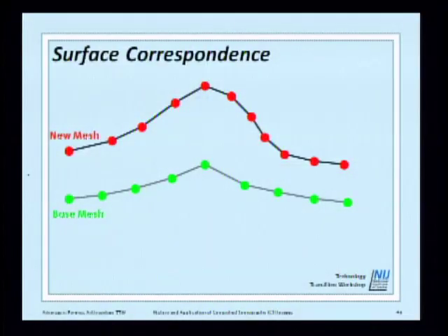So basically, the template deforms, captures the statistics, and then your new bone is added, and at the same time, all its statistics are captured. And we'll try to show you how this happens. So if you have the new mesh, in this case, and I apologize for shifting the colors, this is the new bone that you want to add. And your base mesh, the green, is the template.